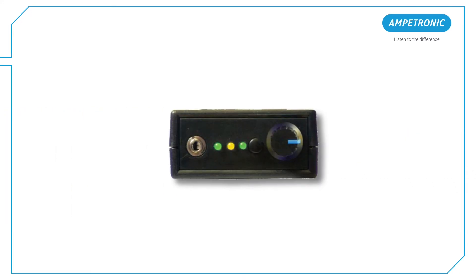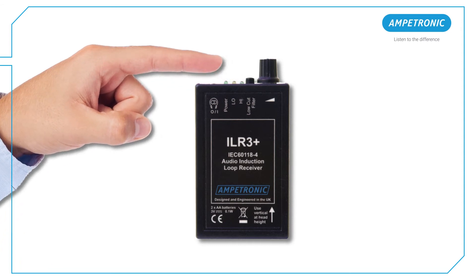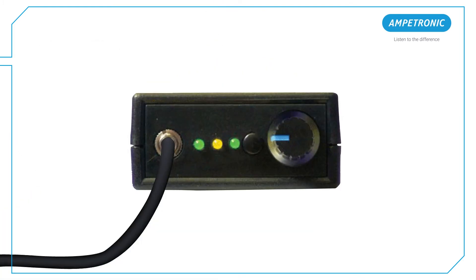On your Ampetronic ILR3 Plus loop receiver, turn the volume down to zero. Set the low-cut filter button to be out. Put the headphones on and insert the jack plug into the socket on the top of the ILR3 Plus — this will turn the ILR3 Plus on. Check the power indicator is lit; if not, then the batteries need replacing.